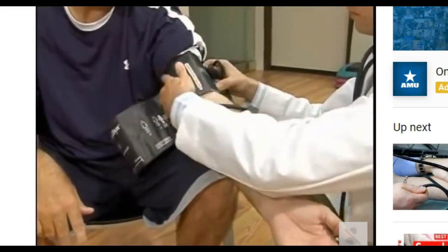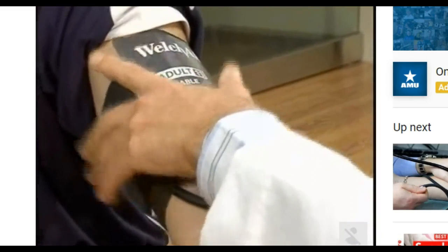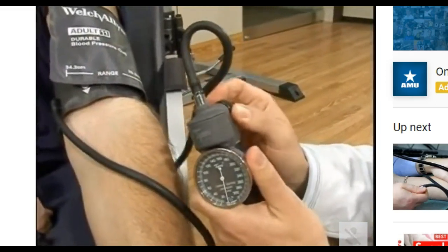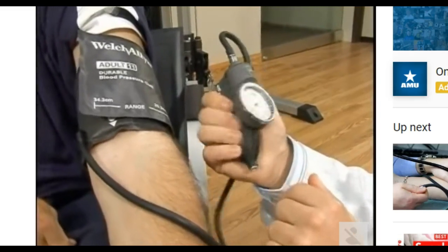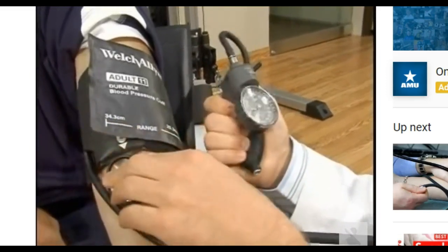The other thing is cuff size. We showed the cuff before as fitting for a normal person. If you have small arms or large arms, you'll have a falsely elevated or reduced blood pressure. So if the cuff is too large for your arm, you'll have a lower blood pressure than you should. And if it's too small, you'll have a higher blood pressure than you should.